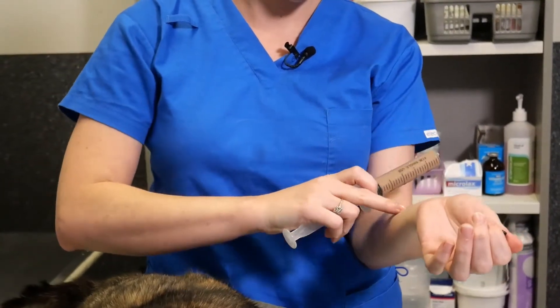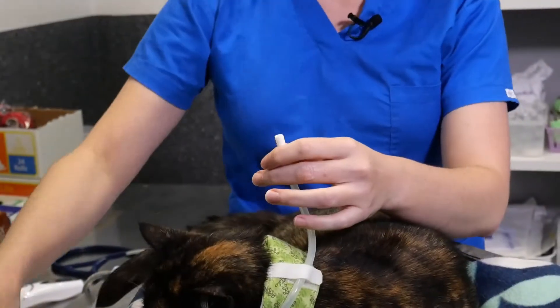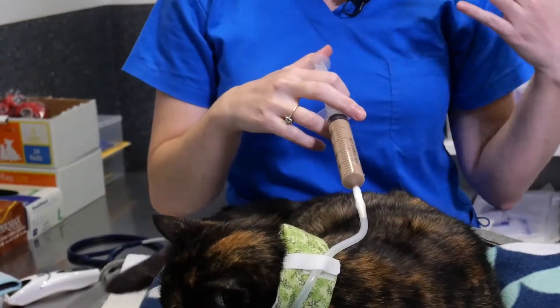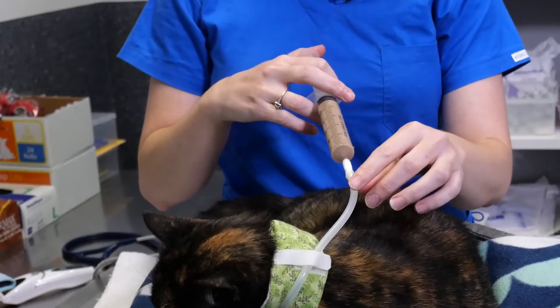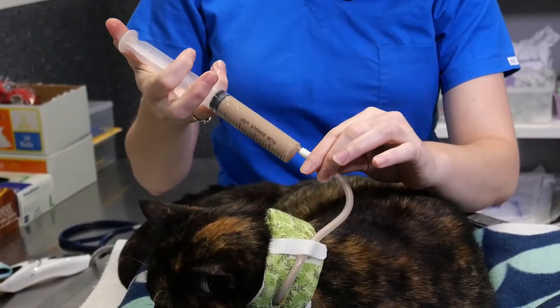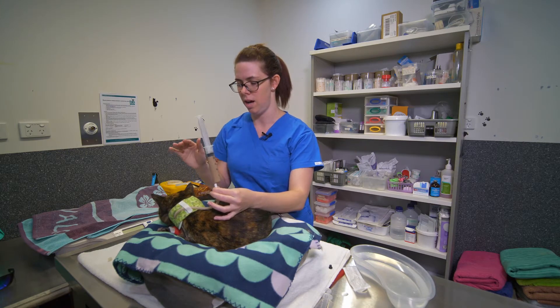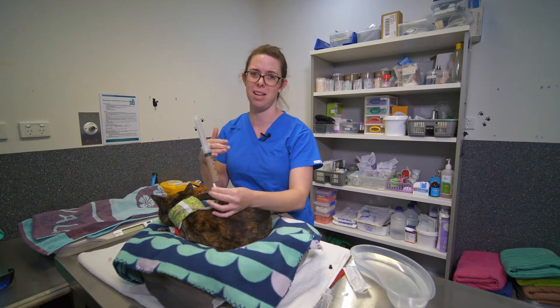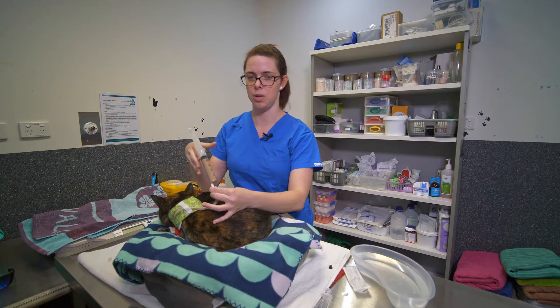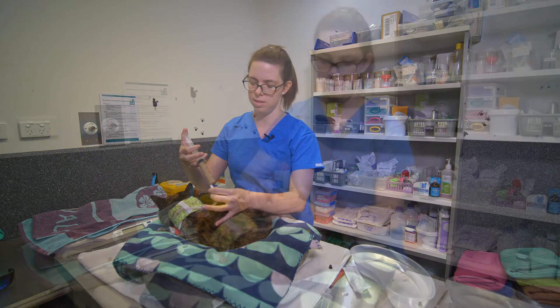Test the temperature — that's warm enough. Undo the cap again and, just like the flushing, go very slowly. Watch out for any signs of nausea, retching, or coughing. If any of those occur, stop and give the clinic a call. If your pet shows signs of hyper-salivating or hard swallowing during the tube feed, you can slow down — it may mean the food is going down too fast. If you've slowed down and the cat is still not tolerating it well, stop completely and call the clinic for advice.